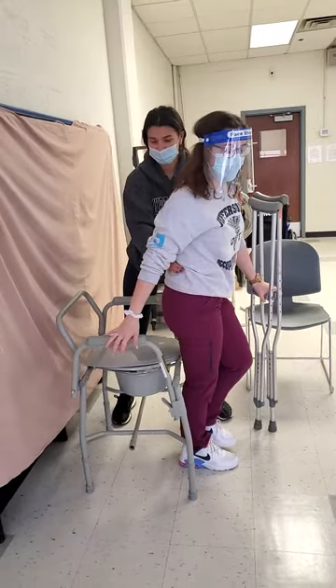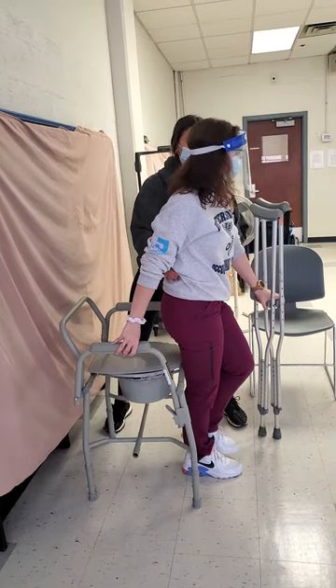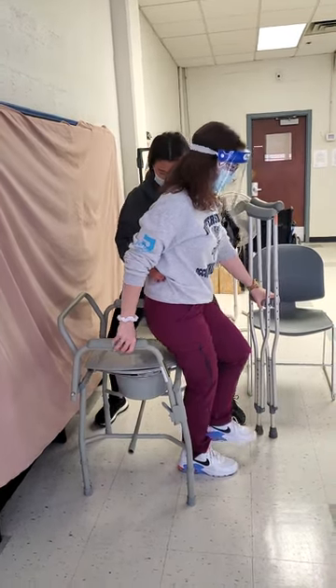And then reach back. Put your arms on the armrest. And on the count of three, we're going to sit. One, two, three.